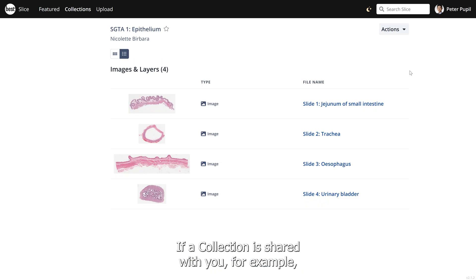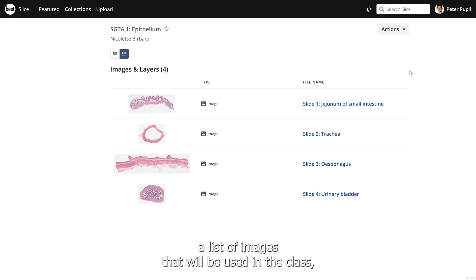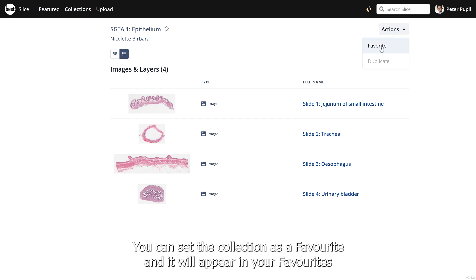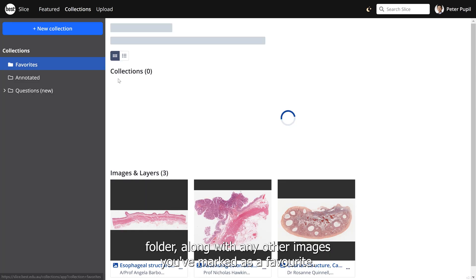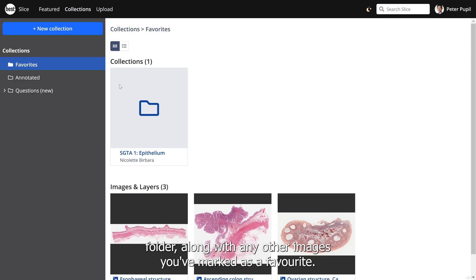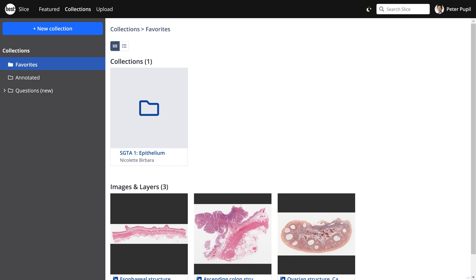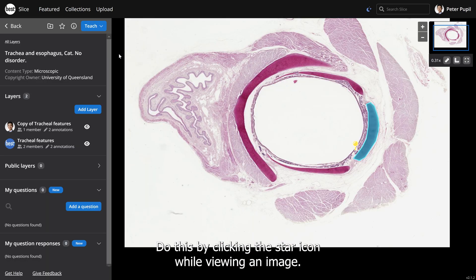If a collection is shared with you — for example, a list of images that will be used in a class — you can set the collection as a favourite and it will appear in your favourites folder along with any other images you've marked as a favourite. Do this by clicking the star icon while viewing an image.